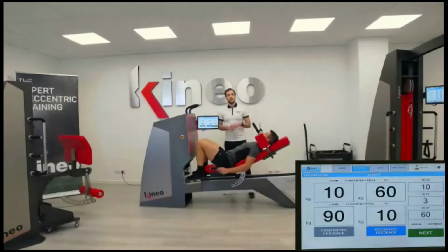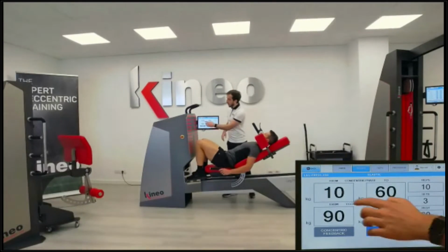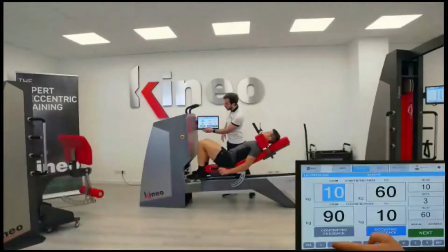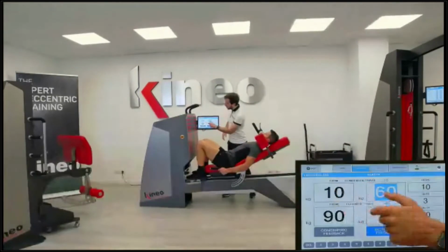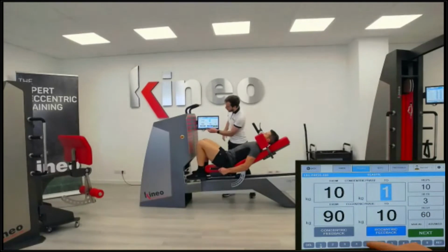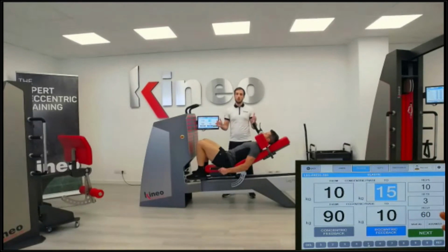And of course, this again is just an example. We could do an elastic with a patient treating ACL, treating tendinopathies, treating Achilles tendinopathies, doing calf here on the leg press. We could do many things. And we can do elastic from 10 kilograms to 15 kilograms, so a very low load even for the leg press.